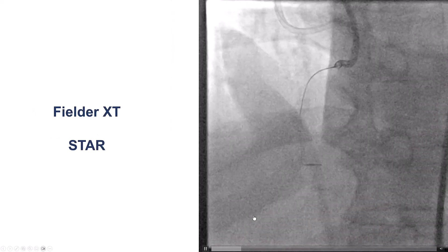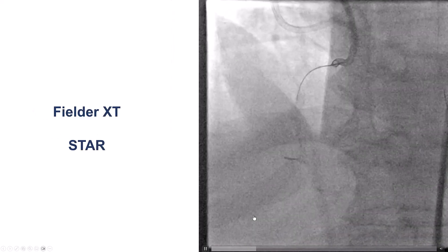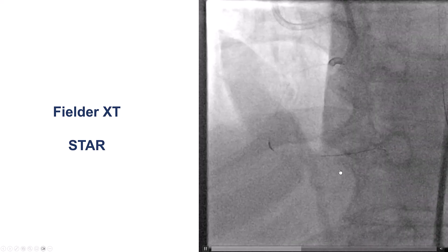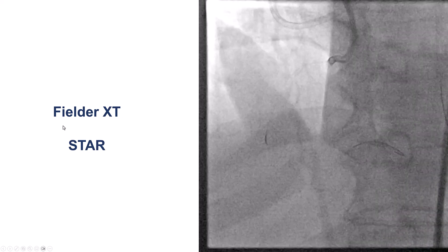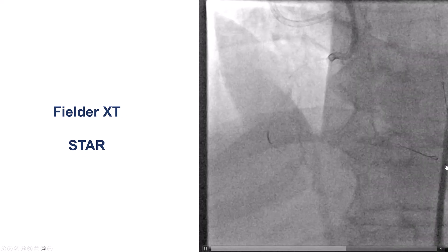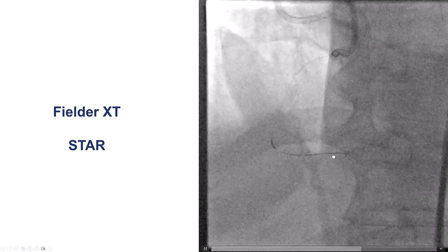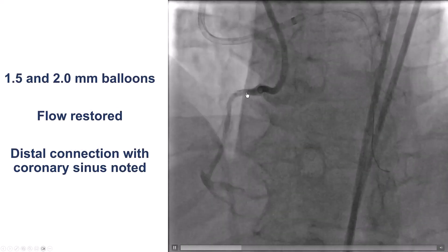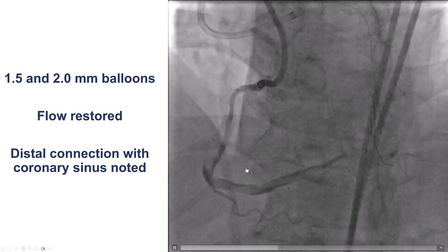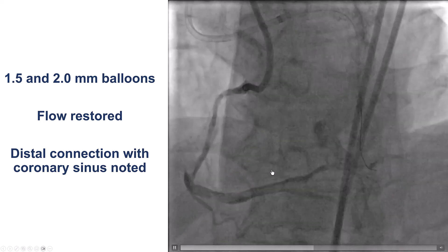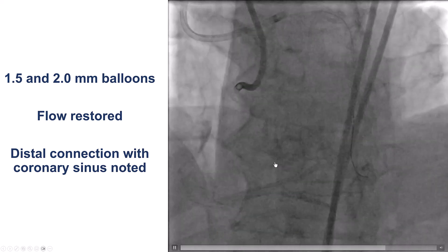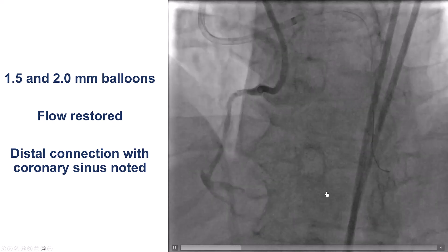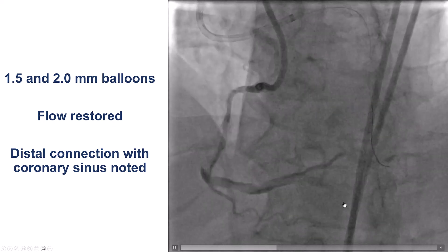After multiple attempts, we decided to use STAR as an investment procedure. We took a Fielder XT guidewire and advanced it distally, trying to restore some antegrade flow, then ballooned it with a 1.5 and 2.0 mm balloon. Sure enough, there was some antegrade flow, though still some dissection on the PDA.